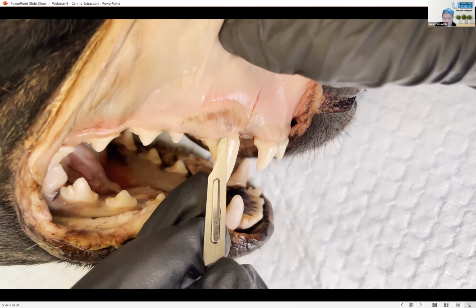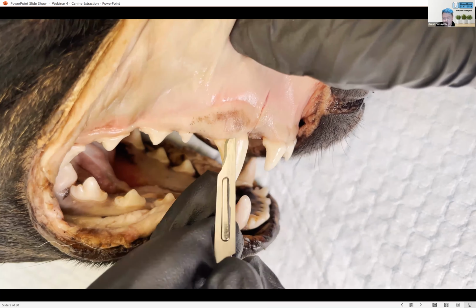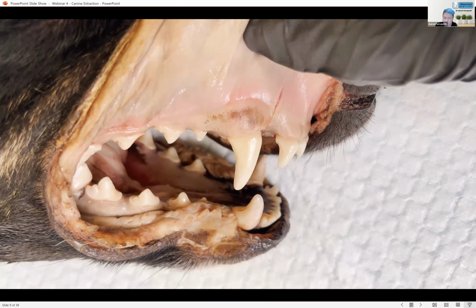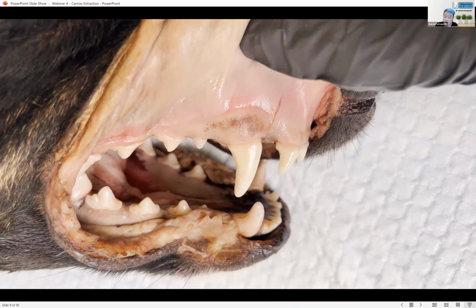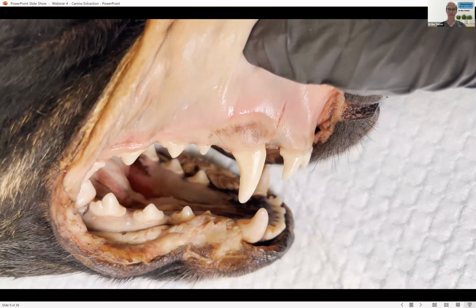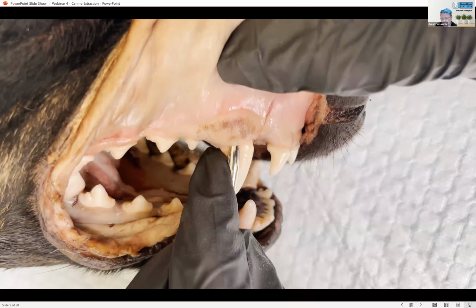Because when Beck gets to it in a second, lifting that mucoperiosteal flap, getting it started, is your hard bit. Getting that gingival lift off the bone. It is very tightly adhered. It should be very tightly adhered. So Beck's also showing there another direction you can go, and where the root is headed as well.